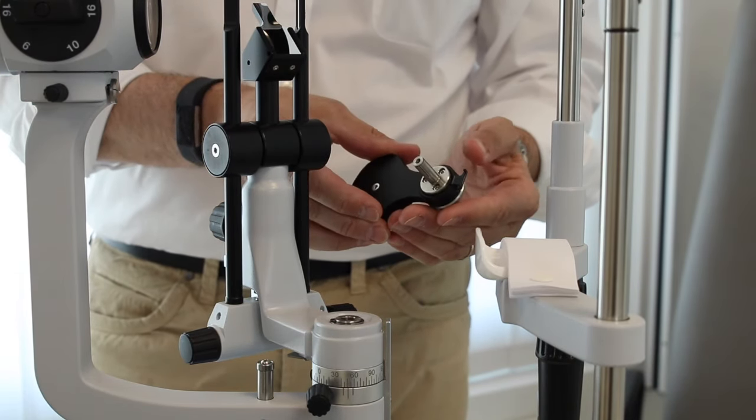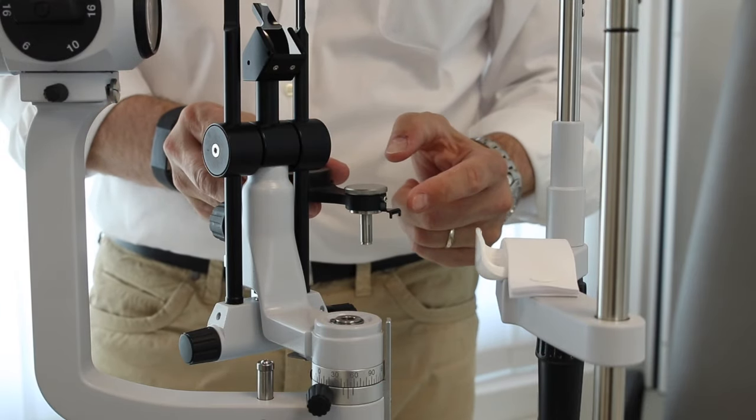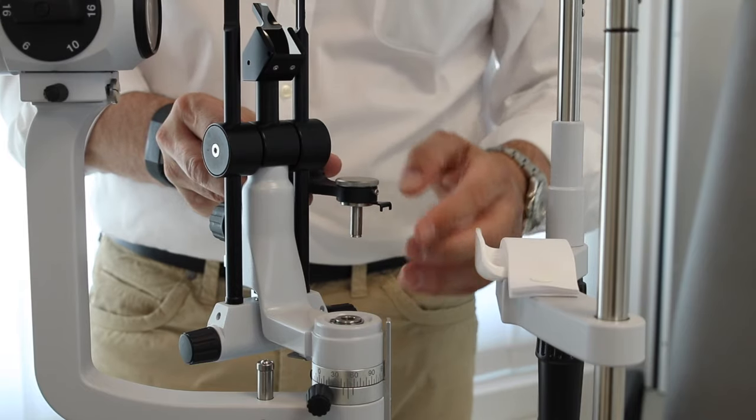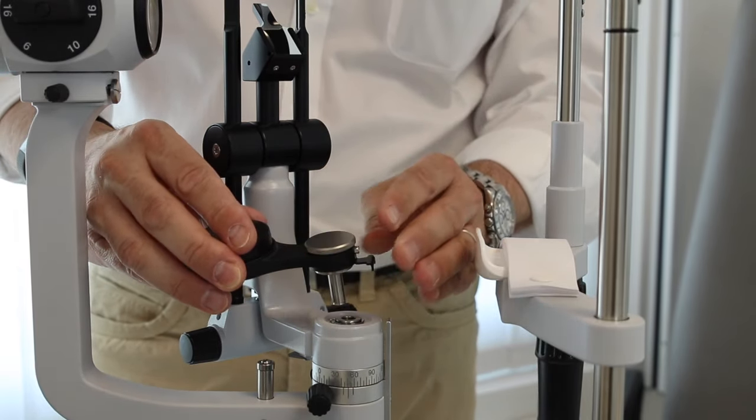Now this is the adapter. This adapter should go in here, and this small element should align there only for Haag-Streit slit lamps. Zeiss slit lamps do not need this.